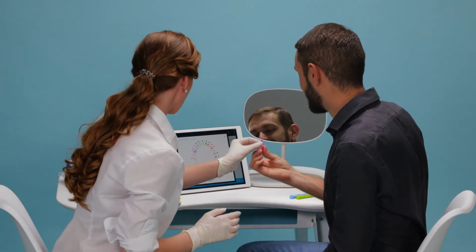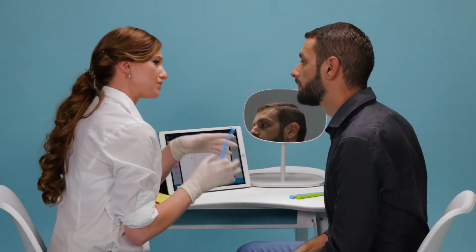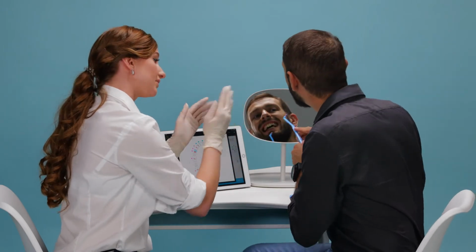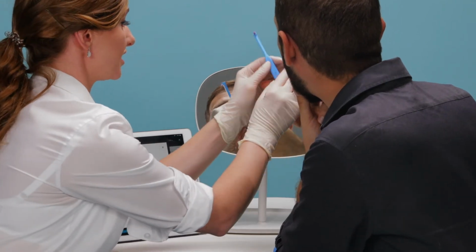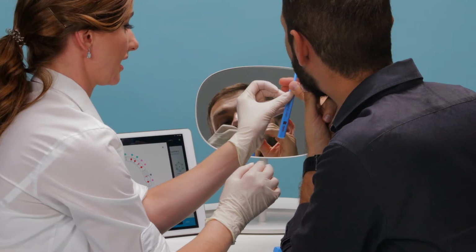I complete the coaching session with the last aid, that being the single tufted brush. Although this is not classed as an interdental brush, Edward has a large interdental space on his upper right sextant. Therefore, I recommend and demonstrate to Edward how to use this aid in that area.